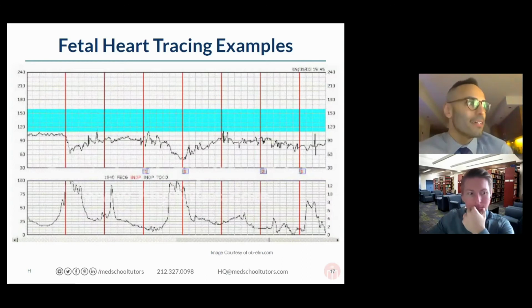Good, hypoxia, excellent. So hypoxemia, that can cause bradycardia, excellent. Fetal hypoxia again, Mario, good job, Exasa, good job. And cord compression. So cord compression is you'll see more of the variable deceleration that's going to be tested on Step 2, but that could be on your differential if you see fetal bradycardia.